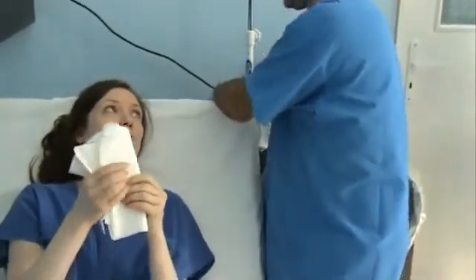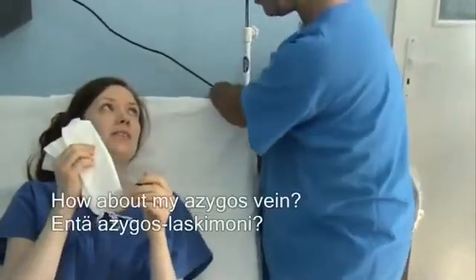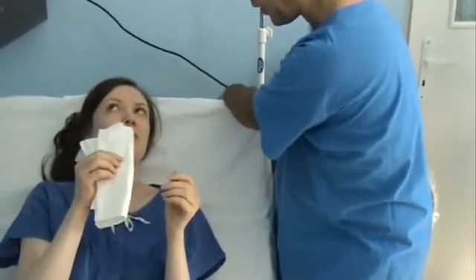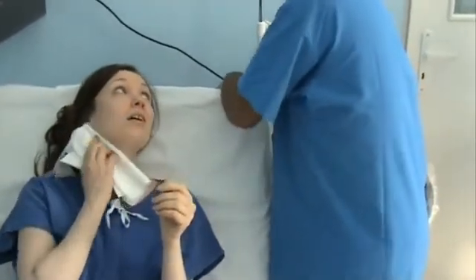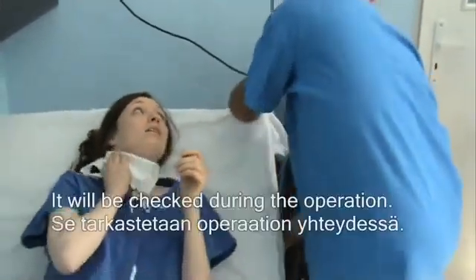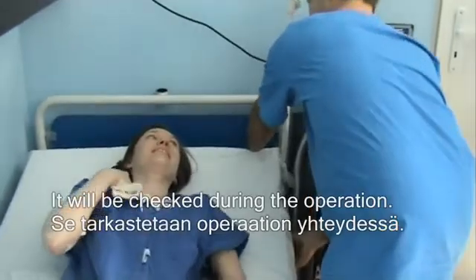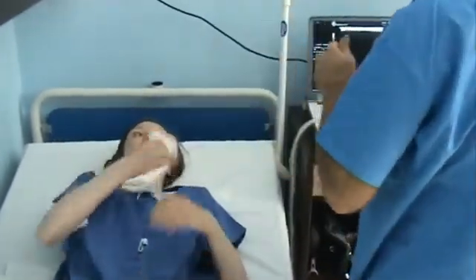How about my azygos? It's inside the chest, so I cannot look for it. But it will be checked during the operation.